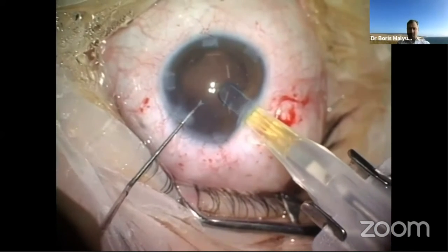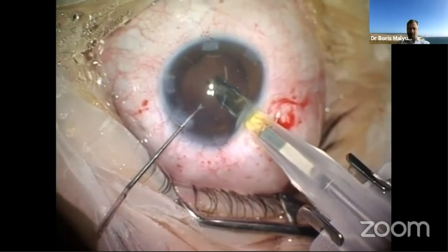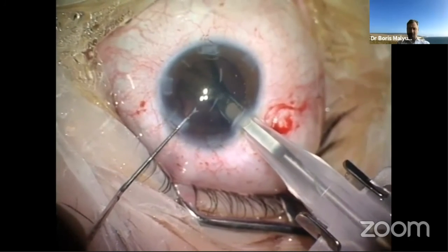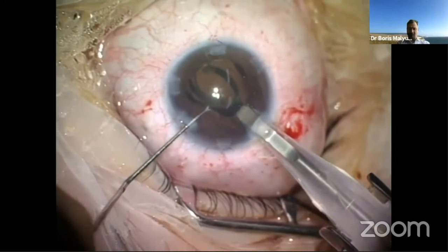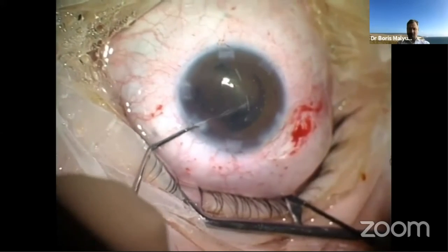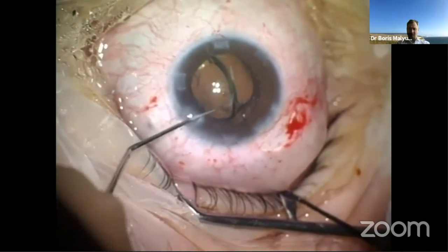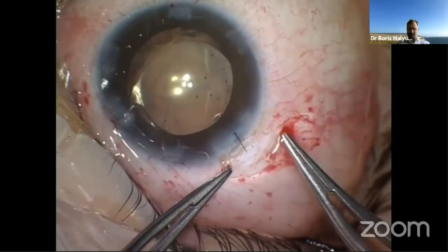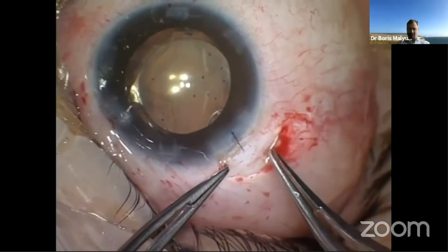This is a hydrophobic acrylic IOL that goes into the capsular bag and unfolds quite slowly in a controlled fashion. So I will be able to guide the haptic into the capsular bag, and then, a very important step, bury the knot inside the sclera.